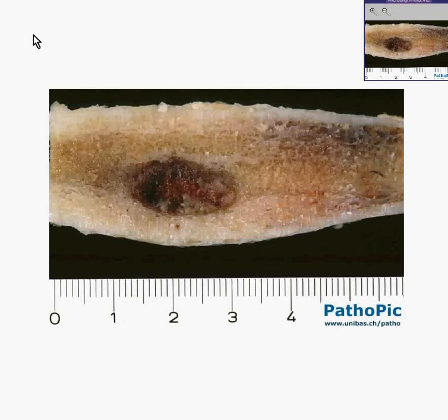Here is a tumor of a bone. I think you could recognize the fact that this is a bone. I think you could see yellowish, kind of fatty marrow here. I think you could see the cortical bone here and here. And I think you could see medullary or spongy or trabecular or spicular bone, whatever you want to call it.